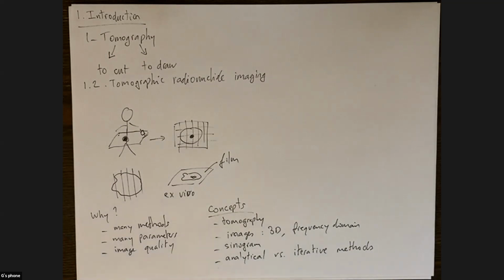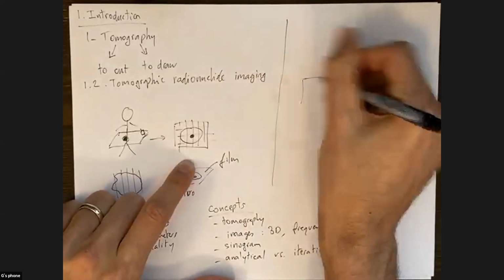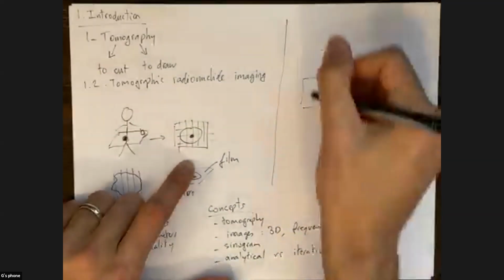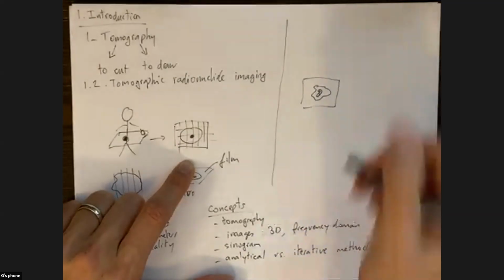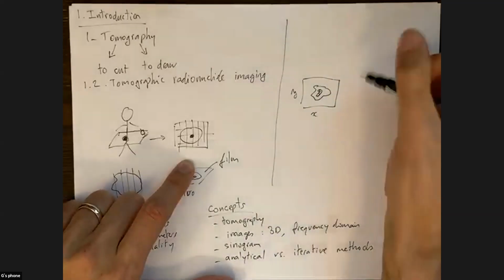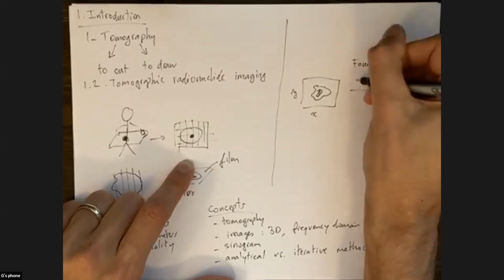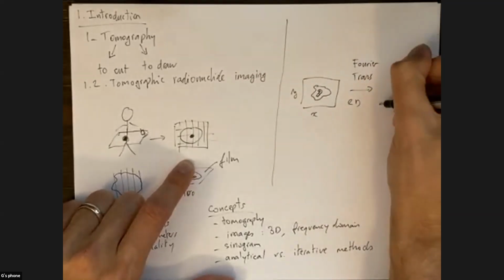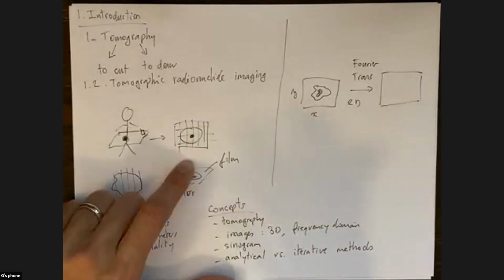And the important thing we talked about is this idea that we can have some kind of image. We'll talk in 2D just to make things simpler, but everything extends to 3D. If we have an image like this, which maybe represents a tracer distribution, this would be X and Y, these are spatial coordinates. We can apply something called a Fourier transform, which in this case is in 2D, and we can get spectral information for this image. This is taking the image into a different space.